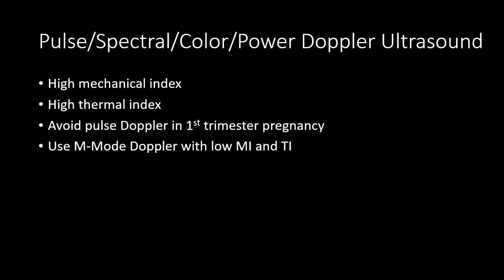Instead of using pulse, spectral wave, or color or power Doppler in the first trimester, we actually use an M-mode Doppler. And that M-mode Doppler has a very low mechanical and thermal index and is therefore felt to be safer for imaging in the first trimester. And we will discuss that in future screencasts.